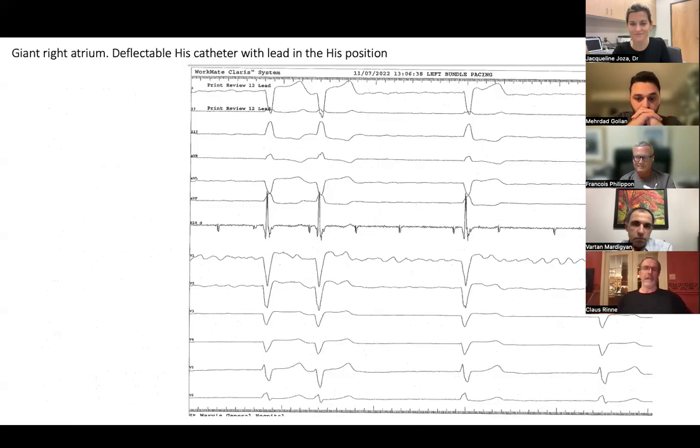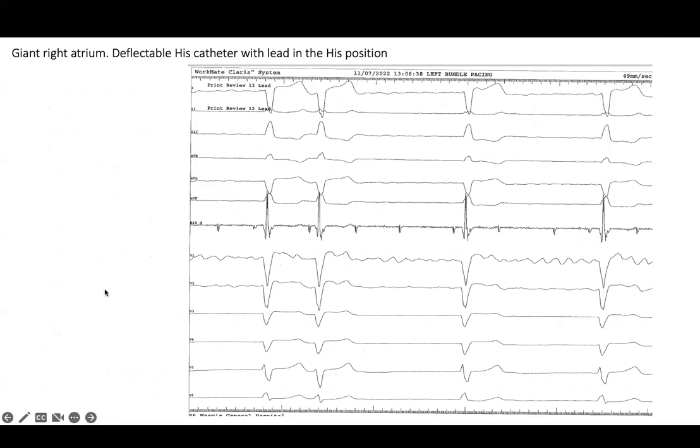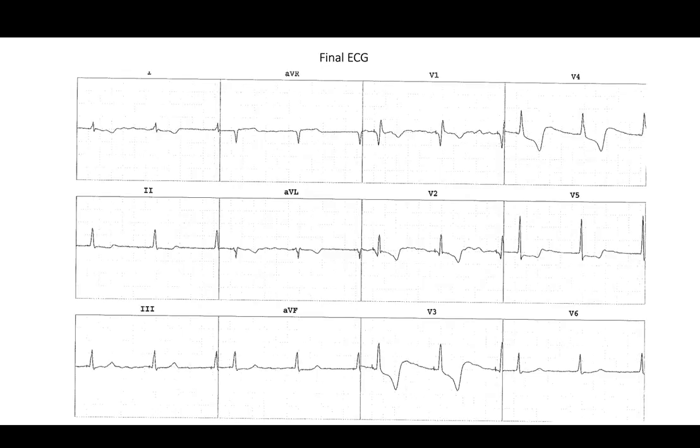So the next one is the intracardiac electrogram. The middle one says HIS-D, so the center one. This is the left bundle, the 3830 lead, in the HIS position. Okay, and I'm still old-fashioned. I try to find the HIS in each case because I think it helps my positioning. I know exactly where I'm starting, and then I can move from there. So this is just a lovely infrahisian block in an AF patient, where you get these irregular HIS signals.